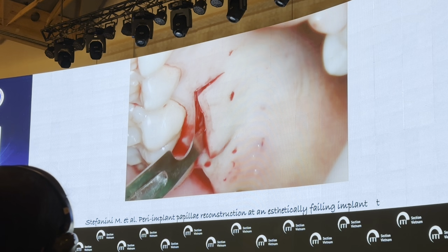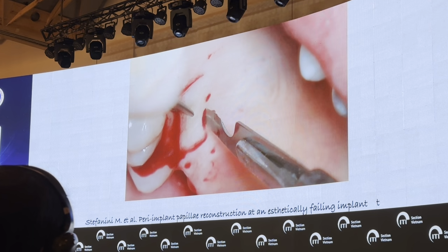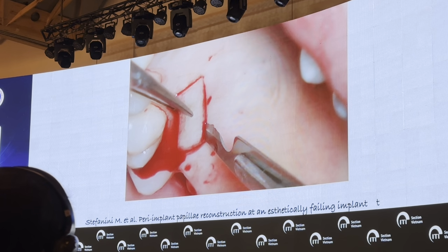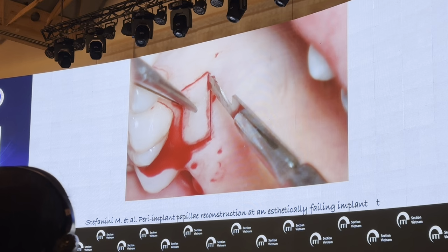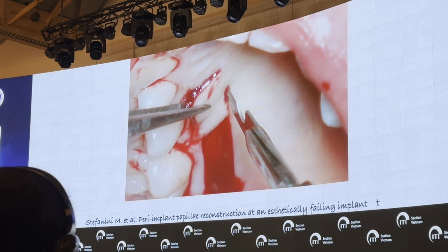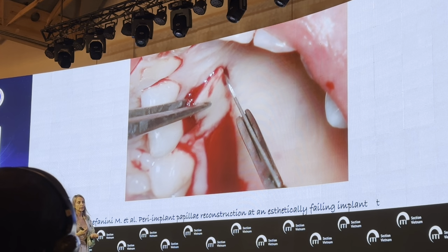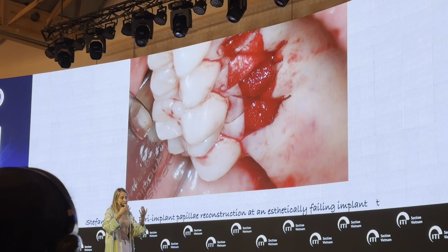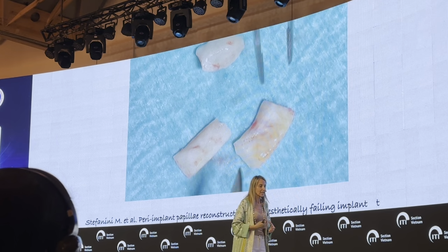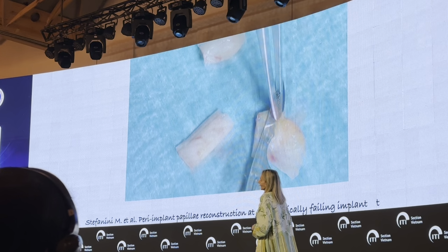So usually I don't like to go to the tuberosity because of the risk of hyperplastic reaction of the tuberosity, but in cases in which I apply this platform technique, the tuberosity can be of help because of the thickness of the tissues, and it is going to be completely covered by the covering flap, reducing the risk of hyperplastic reaction during the healing.